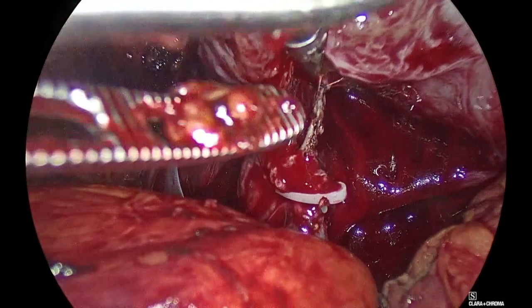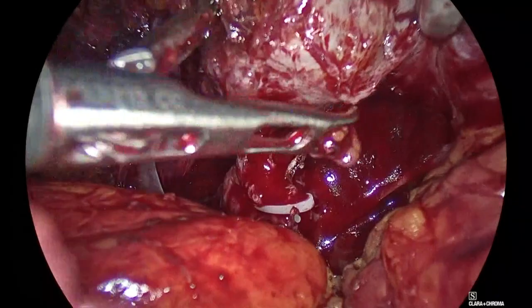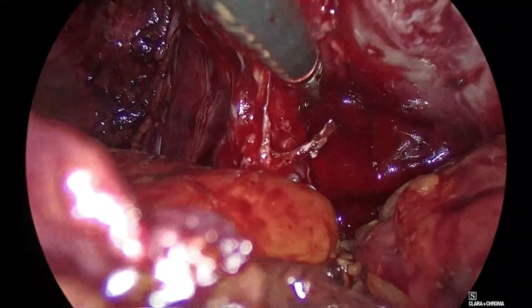You can use whatever you want, Alan. It's not a matter of what you use. It's what fits better in your hands. The important thing is to get your anatomical landmarks. And as you see here, the capsule looks nice. Aspirate here, Panagiotis. Be careful, Padeli. Stay in there and pull it down.